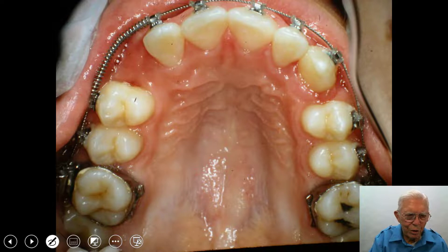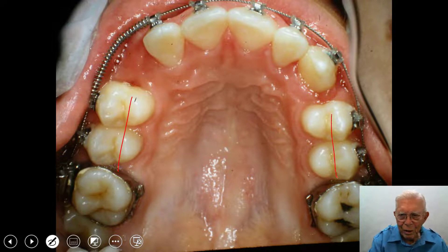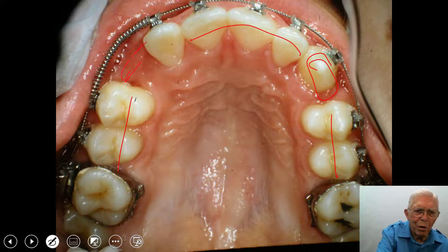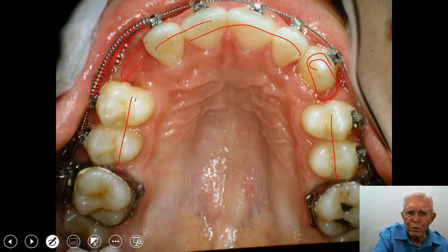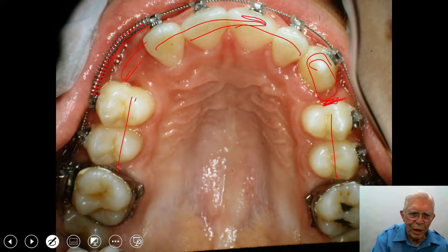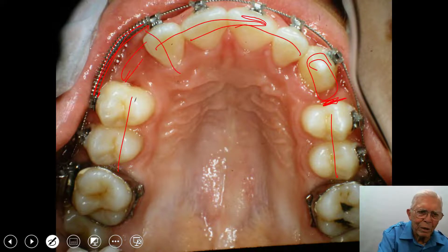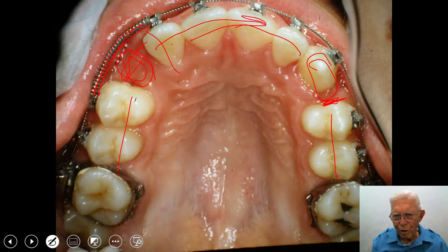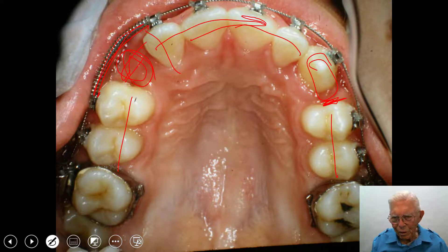Now we've got these two teeth back here, and we've got the cuspid over here. These teeth are tilted over in this direction, so we'll enlarge this. You see we've got a spring over here pushing these teeth in this direction, which will close this gap and open up a space for the cuspid to erupt in — over on the right side.